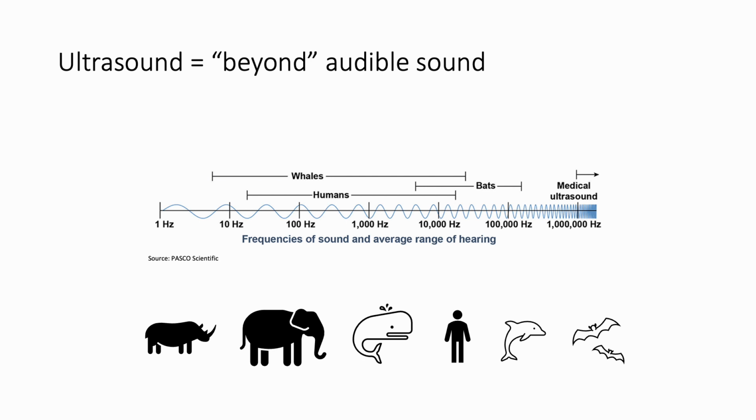And so you can even go higher than that if you utilize different modalities that might be trying to impart a lot of mechanical energy to break up stones or to kill cancer cells. And so thinking of this and remembering that this is a spectrum will be important as we go along down through our physics lesson.